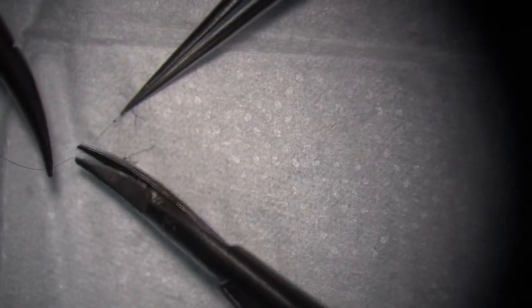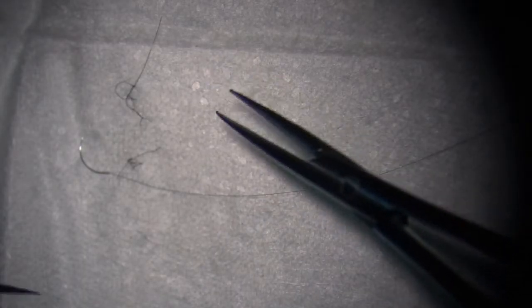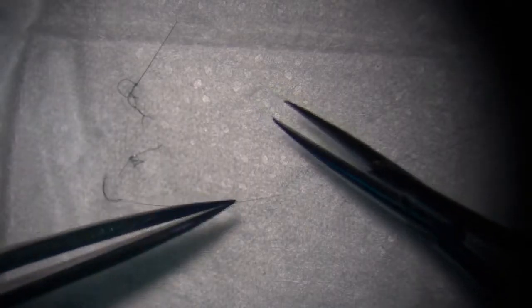Okay, time to cut the suture. I'll give you the suture, and then you try. You can try whichever needle holder you like. I'll try this one with the lock. You can try this one. I'll grab further away.